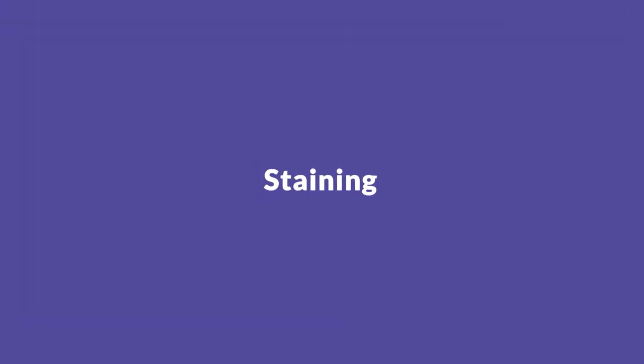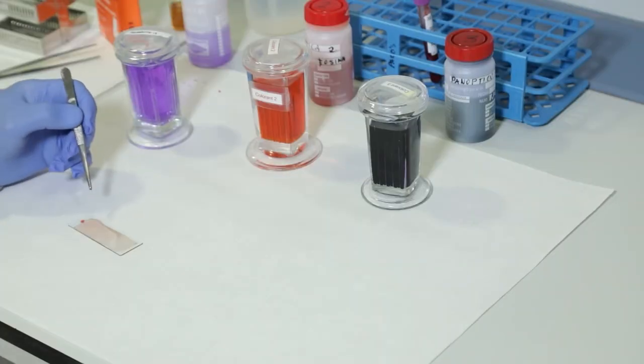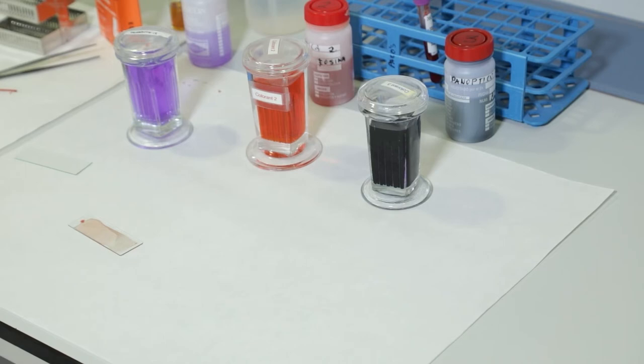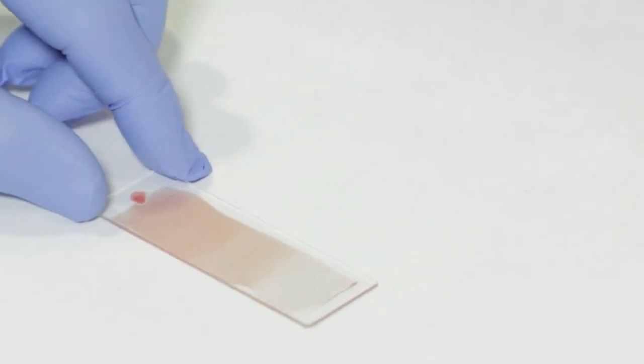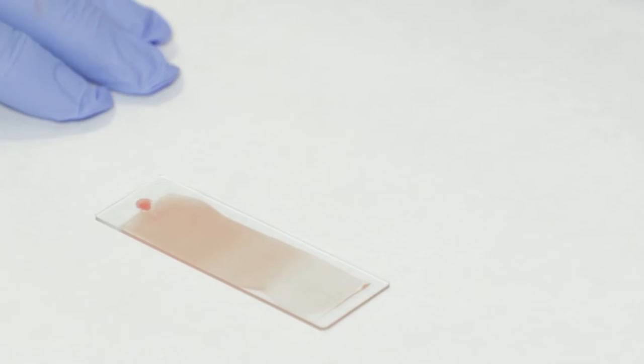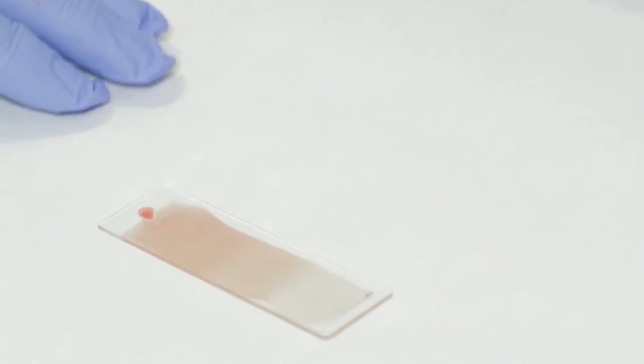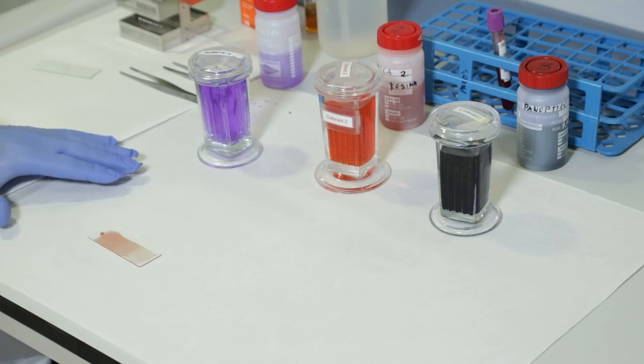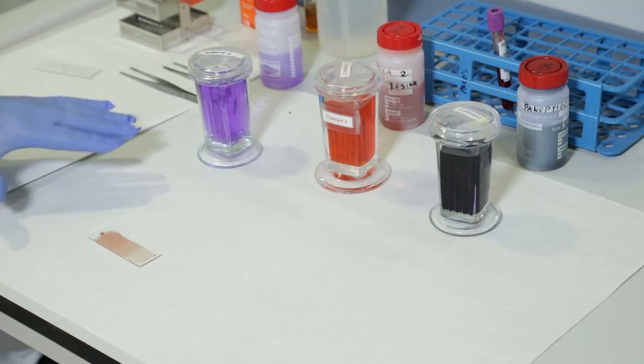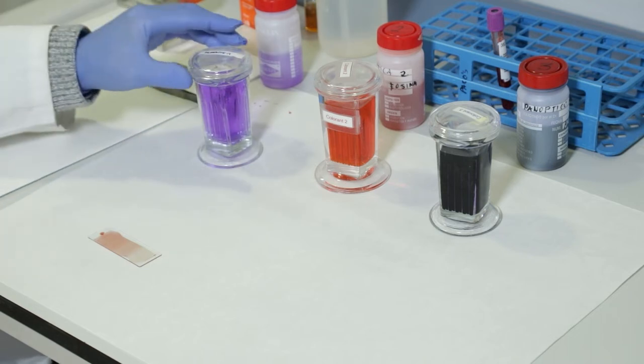Staining. The air dried smear is then stained. The reagents are commercially available. We use the rapid panoptic method. Basically, it consists of fixing the sample and subjecting it to a mixture of acid and basic dyes that stain the cell structures differentially.